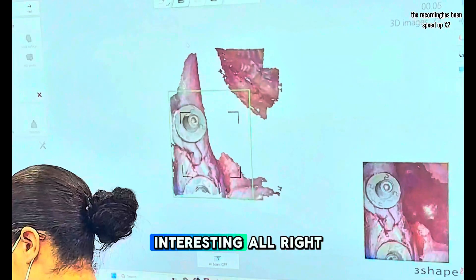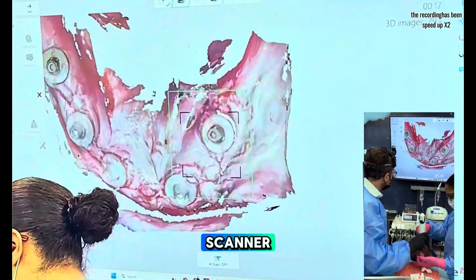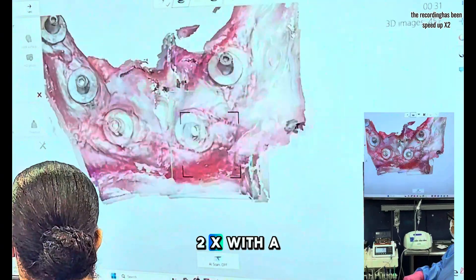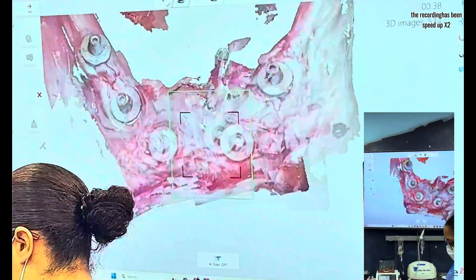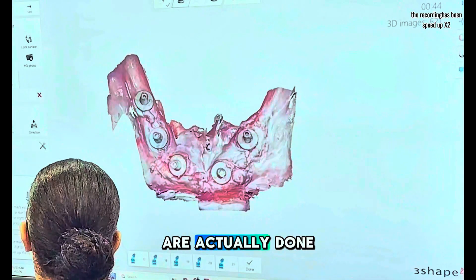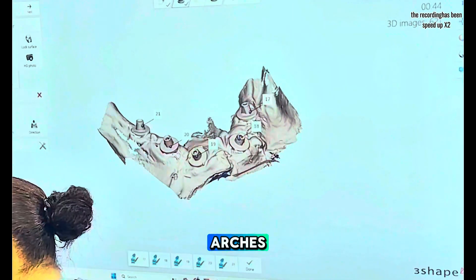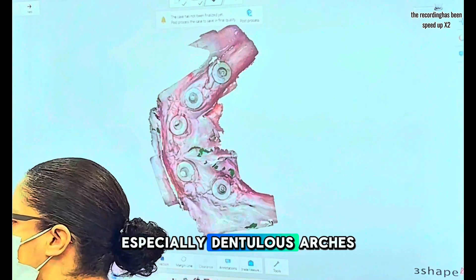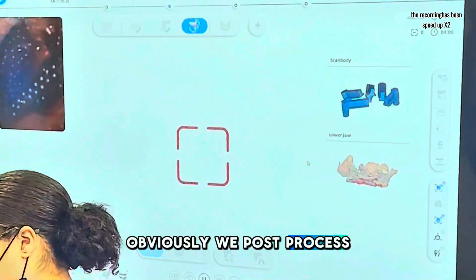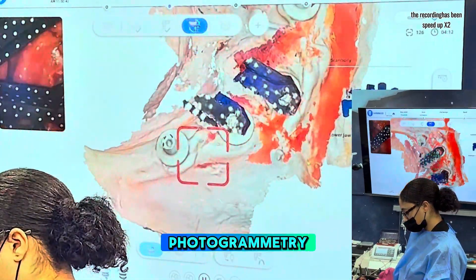I'm not fully sold on it as a soft tissue scanner, but you can see how well and how fast it picks up. I just wish that the box actually corresponded to where my scanner was being held. Now you can see how I'm going to be scanning with the Trios scanner — you can see how crisp and how fast it goes. This is set at about 2.25x. With Trios you get about a thousand images a minute, and you can see how sharp the images are even in a bloody field. This is a Trios 4 — we don't use Trios 5 for full arches, especially edentulous arches.